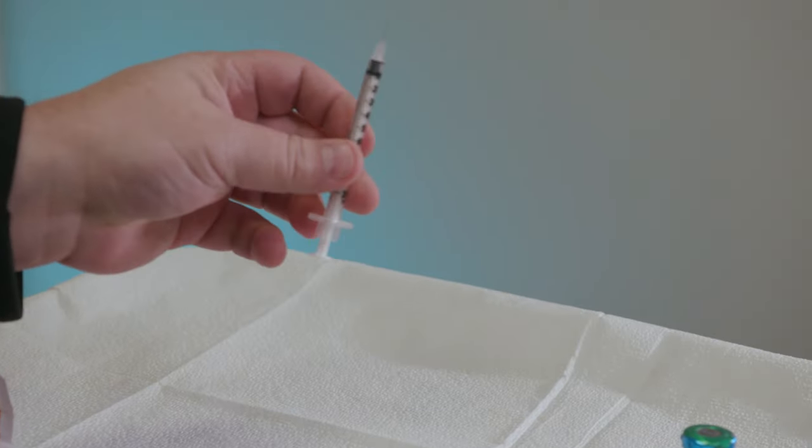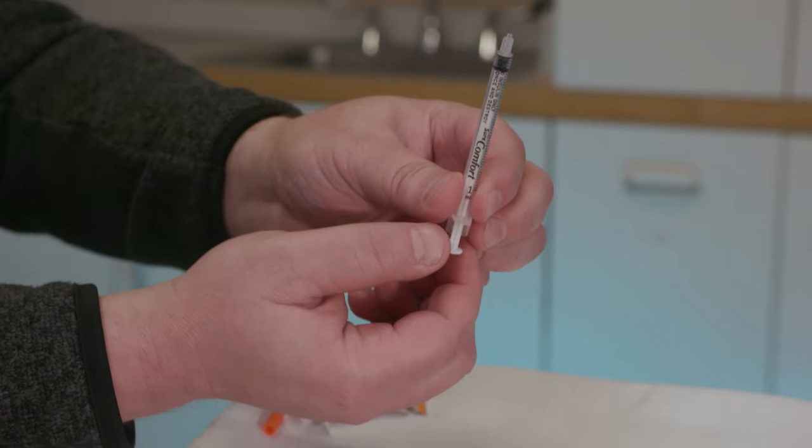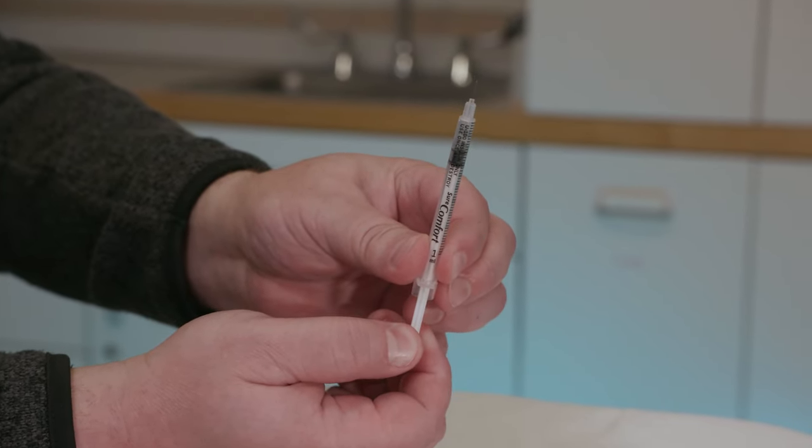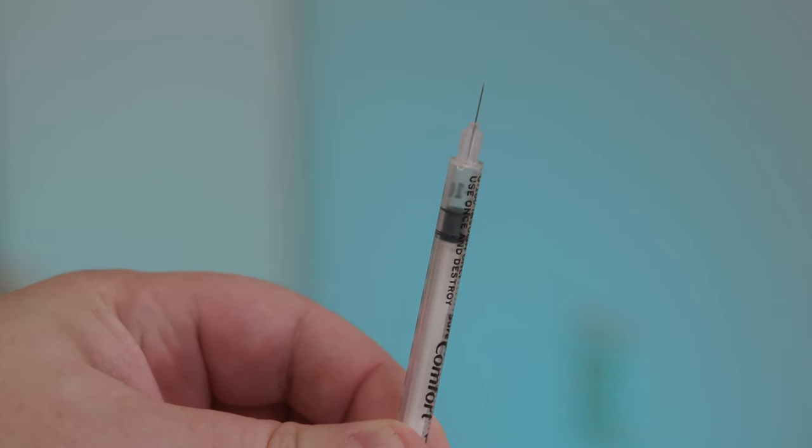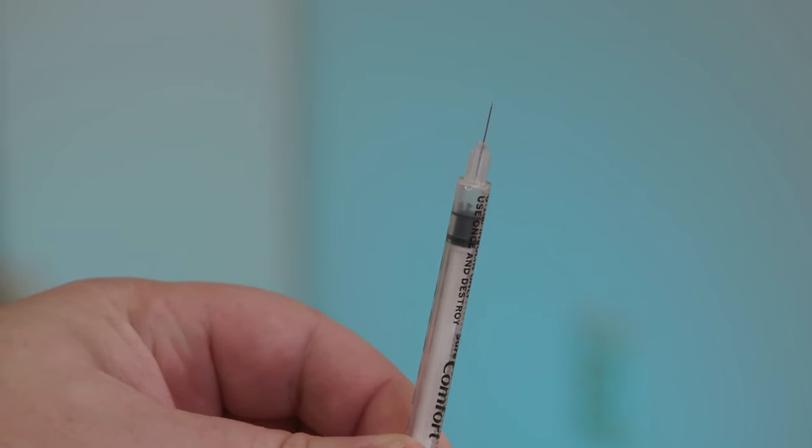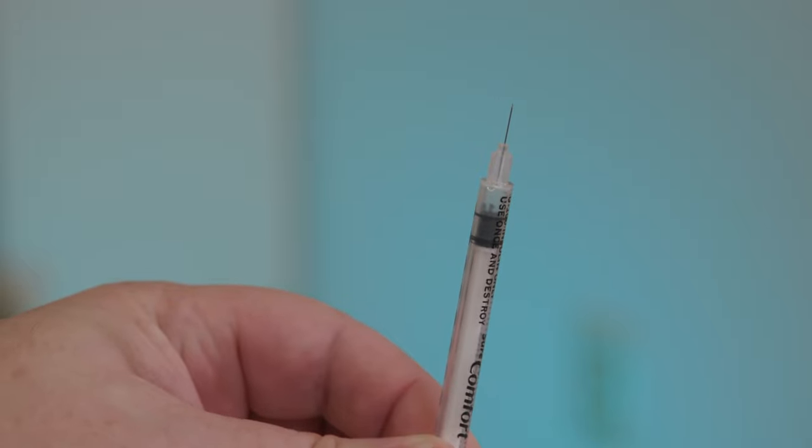Holding the syringe with the needle pointed up, pull the plunger back past the dose your care team told you to inject. Then, push it back up until the top of the plunger, the part closest to the needle, is at the dose you need to inject.